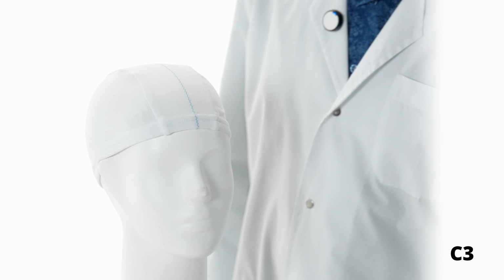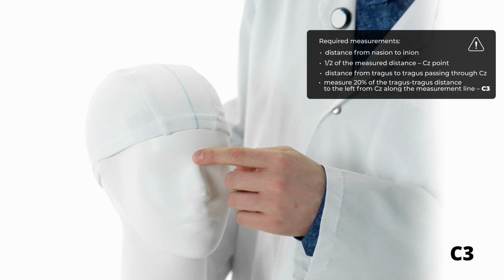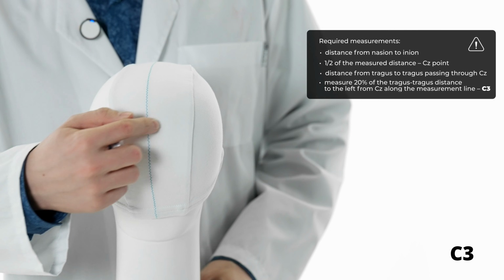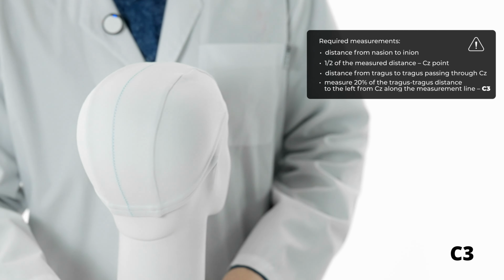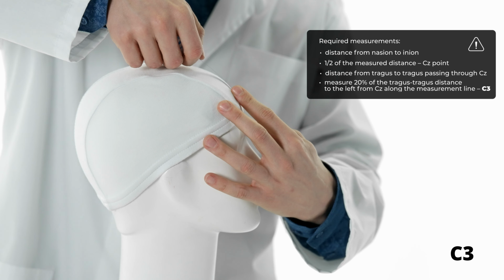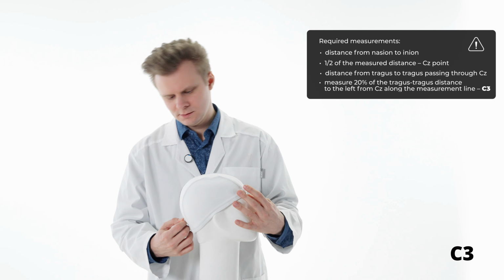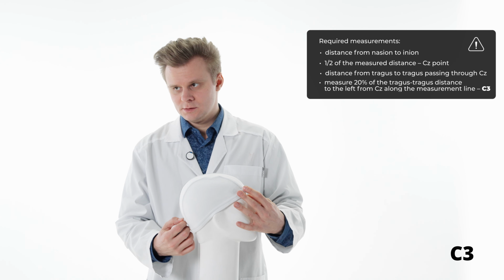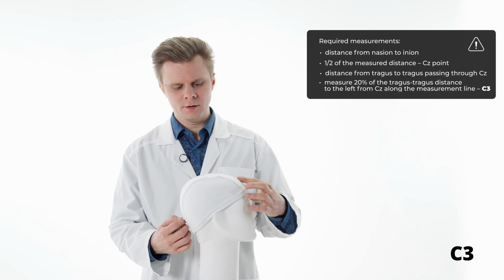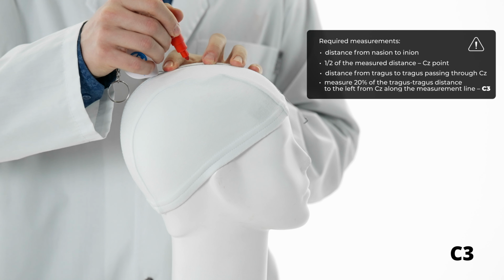First of all, make the circumferential measurement between nasion, the point between the nose and the forehead, and inion, the most prominent tubercle on the back of the skull. In our case, this distance equals 32 centimeters. Mark CZ point that lies right at the middle of this line, or at the 16 centimeters from the inion or from the nasion.